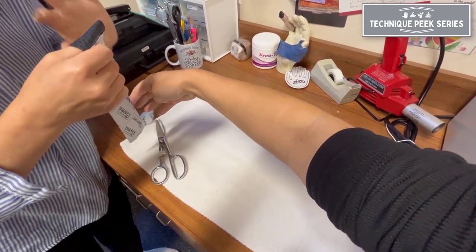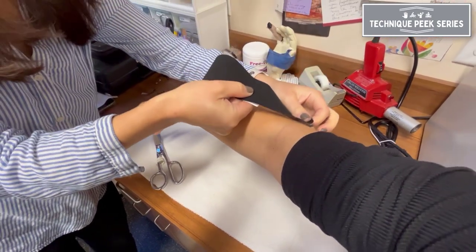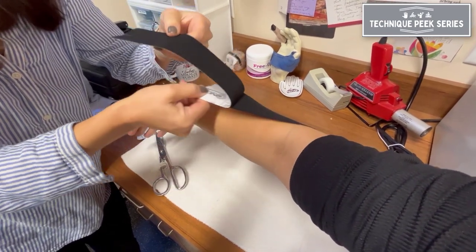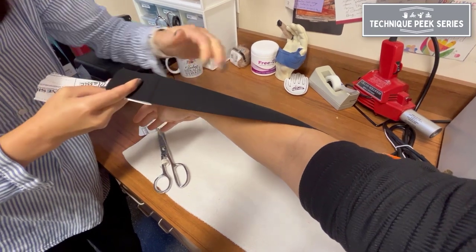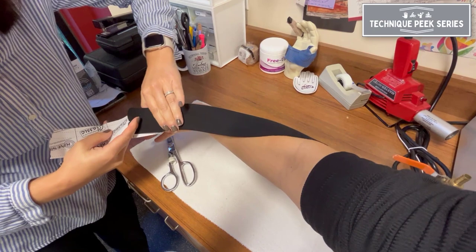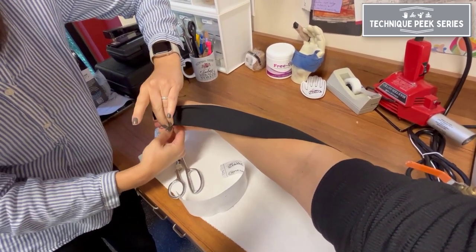The proximal end of the tape is applied with no tension. Then apply the remainder of the tape with 15 to 35% tension until you get to the distal thumb area. The tails of the distal thumb will be applied with no tension, just underneath the distal phalanx.